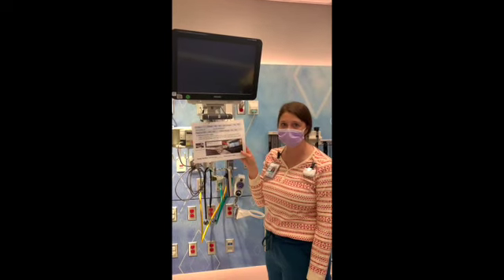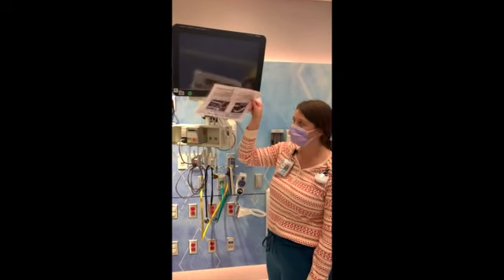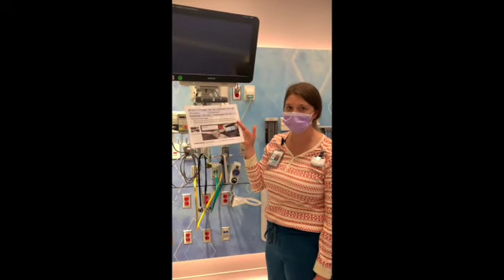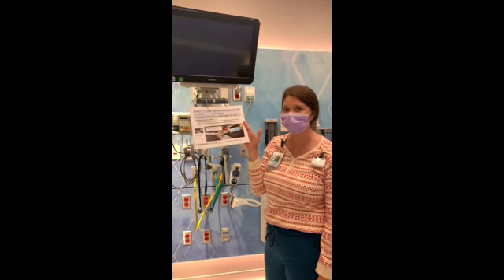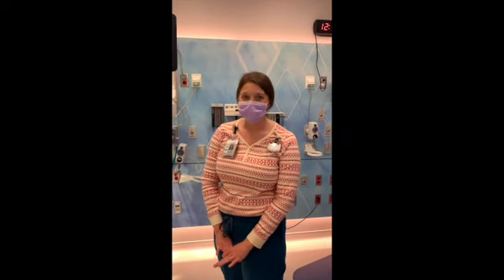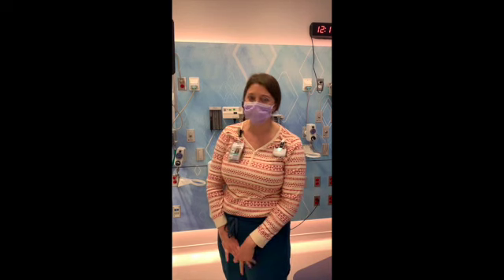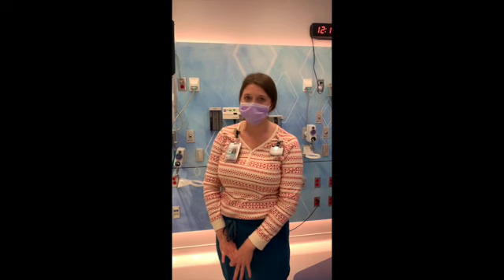Suction card. On one side is your ET tube, the other side is your trach safe suction. But we put them in every single room, so they're attached to the monitor, so please don't take them down. Thank you. Lately on safety checks, we've been seeing some increase of alarm limits being changed, so please make sure that you're not changing them unless you have an order for it.